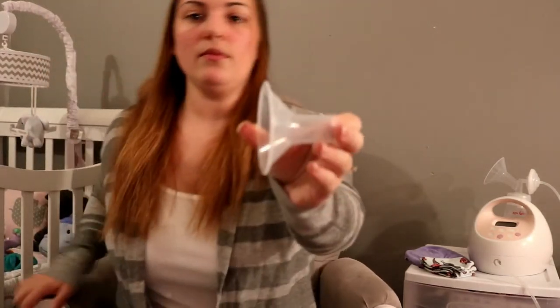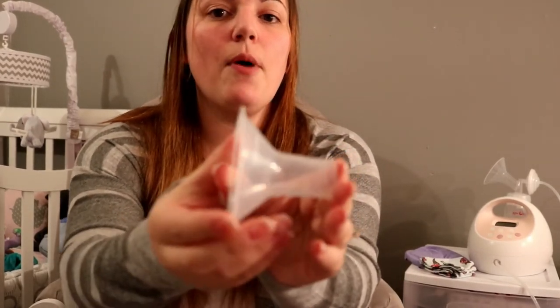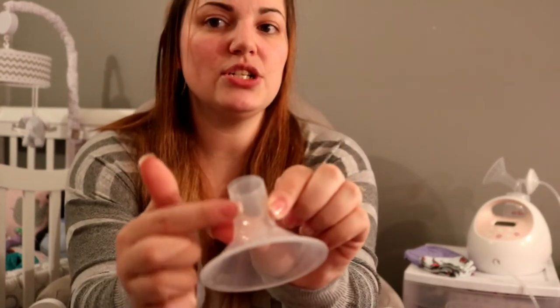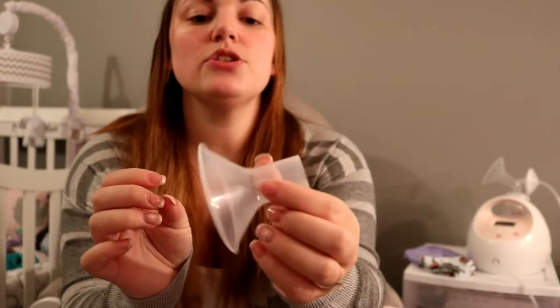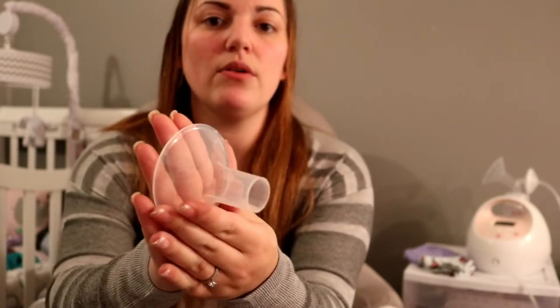This is a basic flange. The part that goes around your nipple is this inner cylinder right here. You do not want your nipple to rub along the edges. You don't want it to hit the back — you want it to freely flow in the center back and forth to get the best out of your milk. You do not want too much areola pulled in and you do not want not enough nipple. Pumping should be comfortable, so if your flange is uncomfortable chances are you either need to size up or size down.